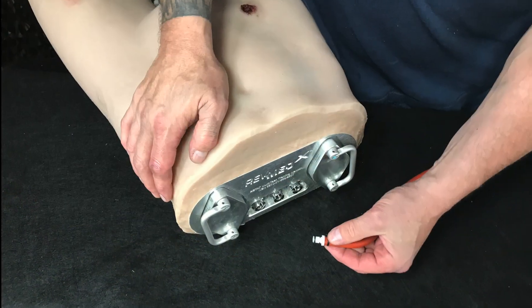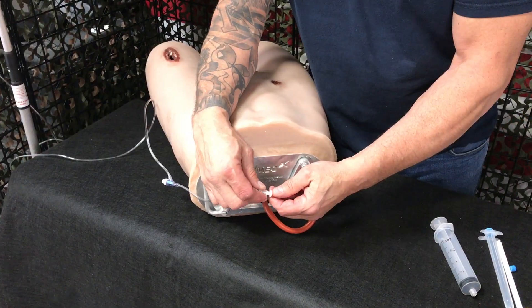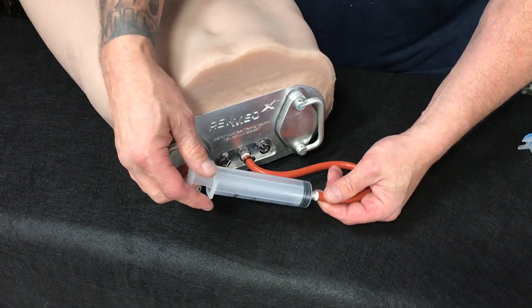Alternatively, you can use one of the provided hoses which are fitted with a standard lure lock connector that easily connects to an IV bag or 60cc syringe filled with simulated blood. This allows you to titrate the amount of bleeding you want for your training scenario.